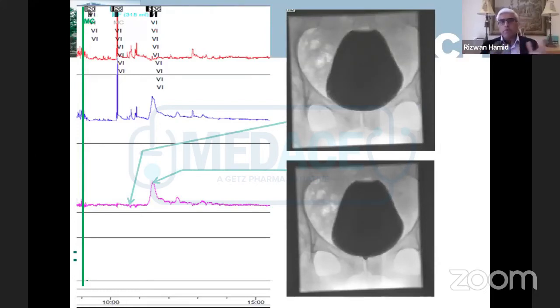Before you start doing the urodynamics, what is the question? What are we trying to answer? Are the symptoms in the storage phase, in the voiding phase, or is it a neurogenic component? It is just like doing a CT scan. We send the patient to the radiologist with a CT scan for, let's say, a stone. The radiologist will comment on the stone.